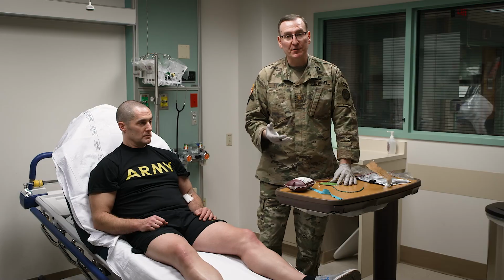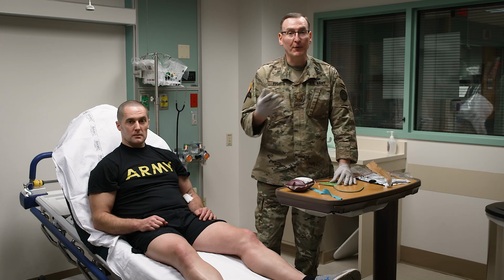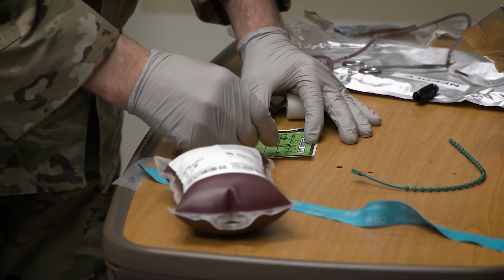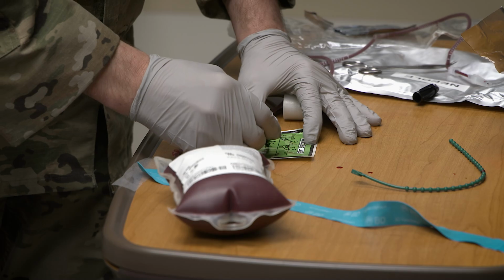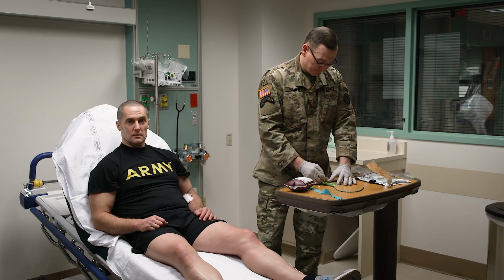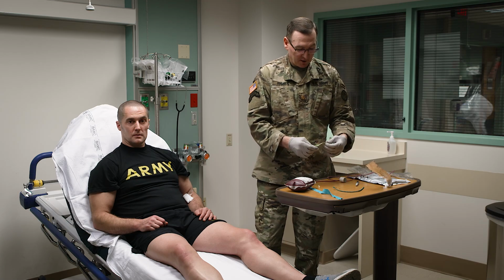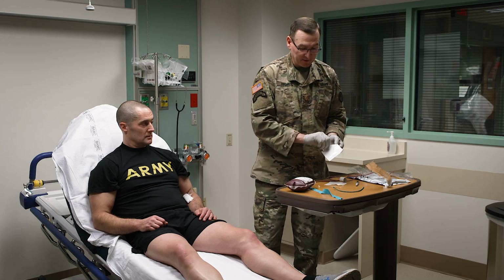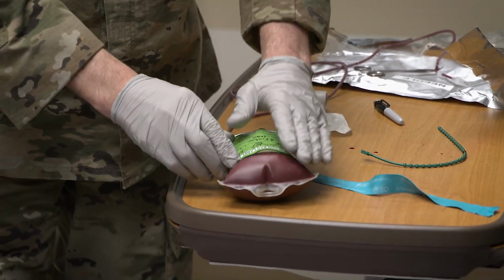If this patient is a low titer, it's important that we talk about whether this person is a low titer or not, whether this person can donate to everyone versus a type-specific or group-specific blood transfusion. And it's collected by, so who you are, the time it's collected, who's going to administer it, and the time that is administered. Those two can remain blank for now until it is handed off to the person who collected, because it may not always be you who collects it and does administration. So it may have to go to someone else who can then provide that blood administration for you.